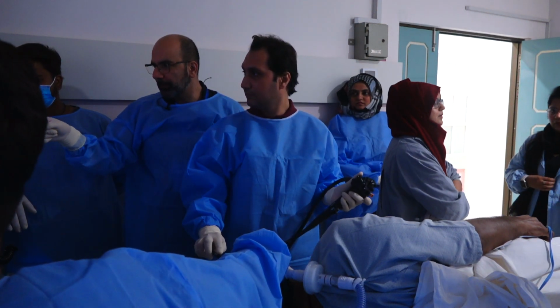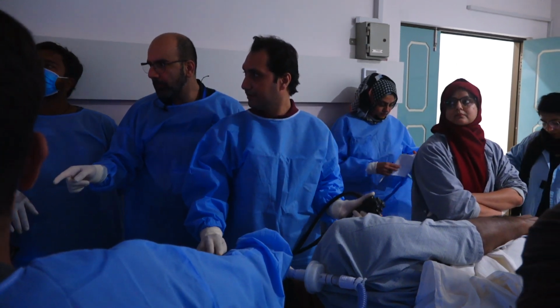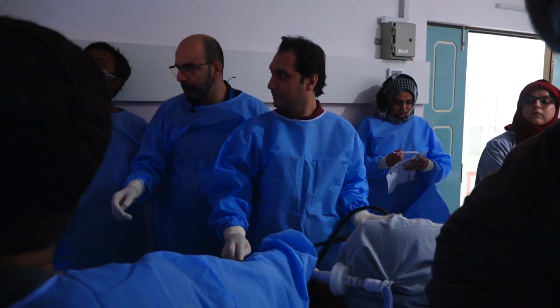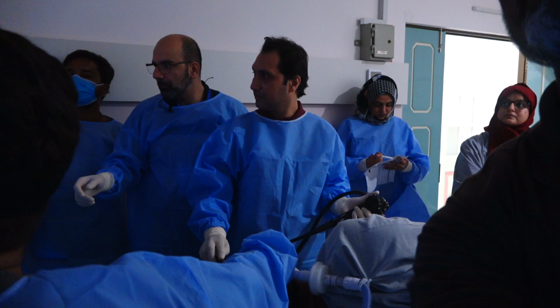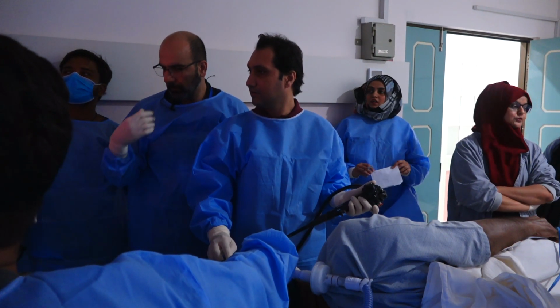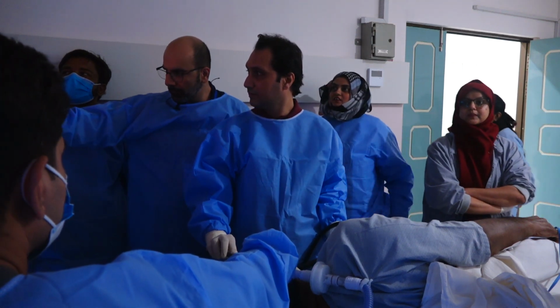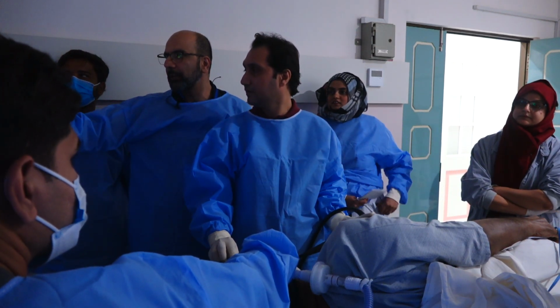So we're still not in the stomach, right? Or are we? Yeah, I was there. I just came back. Okay, show me the stomach. Good. Now, Mustafa, we can hear you, but we can't see you. We're trying to get to that. Okay, now we can see you as well. Just make sure you're nice in the stomach. Okay, now you know you're in the stomach.